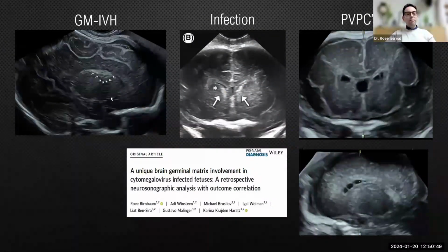I will not talk about the later events that occur in the germinal matrix because you've heard fantastic talks by Dario, by Daniela, by Moran, and by Gustavo regarding various insults that involve the germinal matrix. It can be a variety of bleeding, infection involvement, and we described this unique phenomenon that occurs during the third trimester, in which the germinal matrix of the head of the caudate becomes echogenic in CMV cases, and we described the outcome of these children.